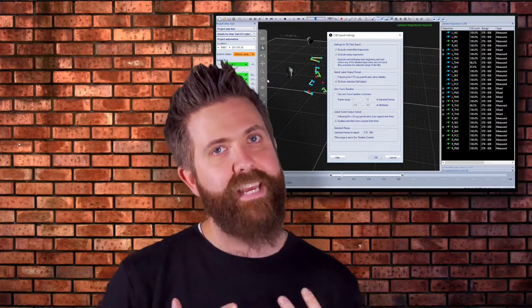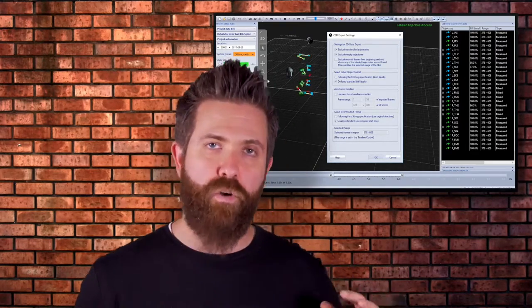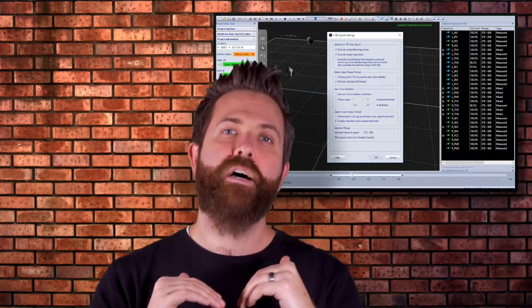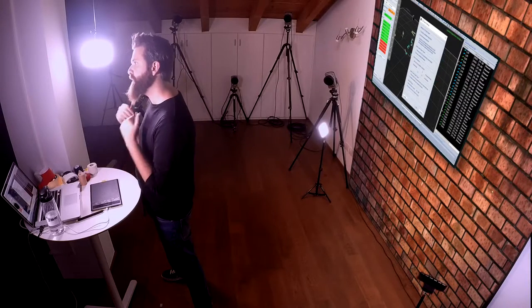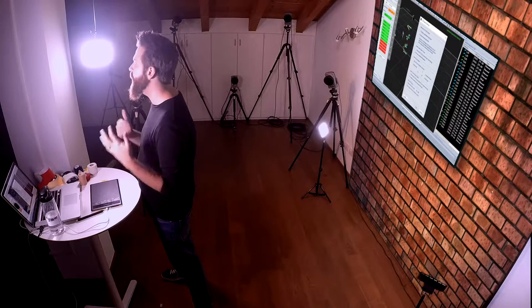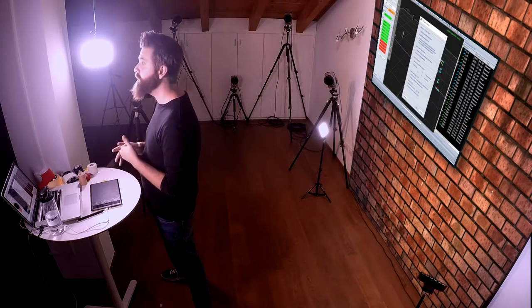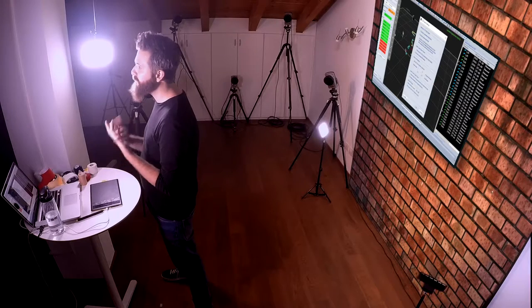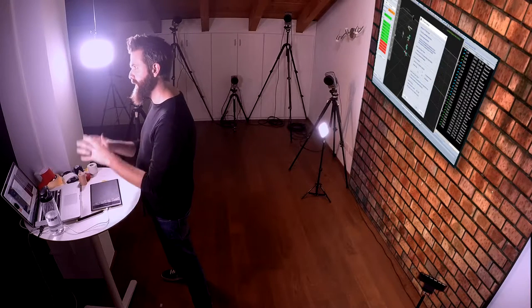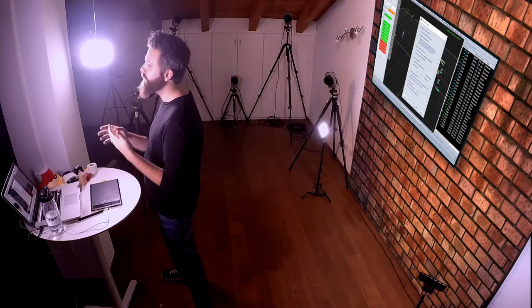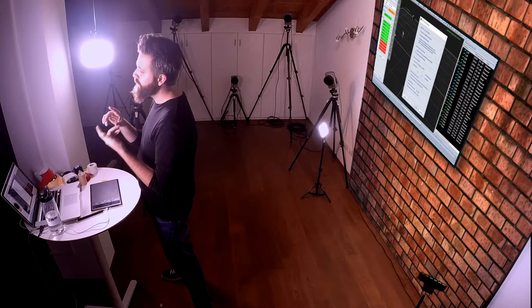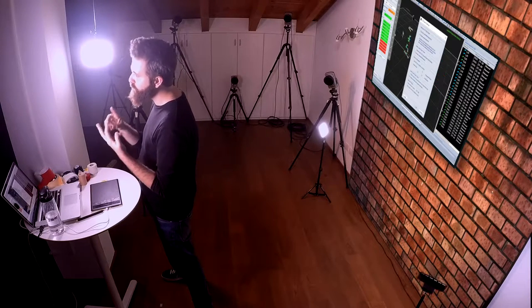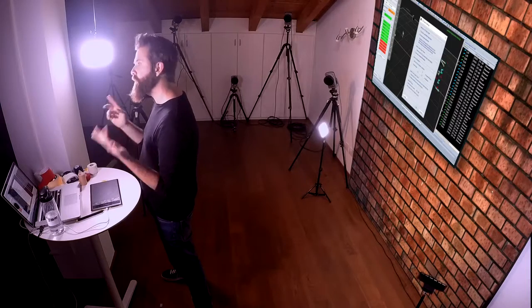Obviously in this case all we have is kinematics because we don't have force plates in our studio, but force plate data can be in here as well as other types of analog data including EMG. The most common type of data that you're going to see in a C3D file includes kinematics, forces, and EMG.